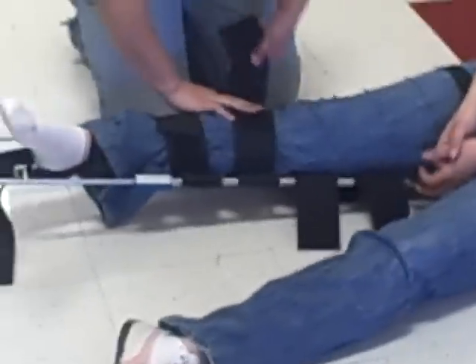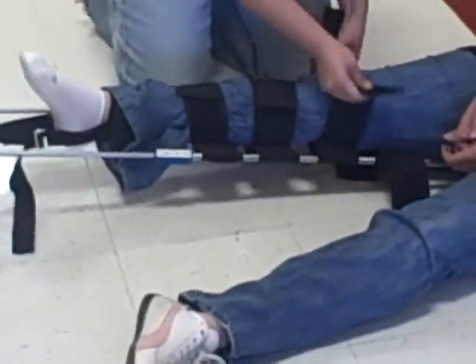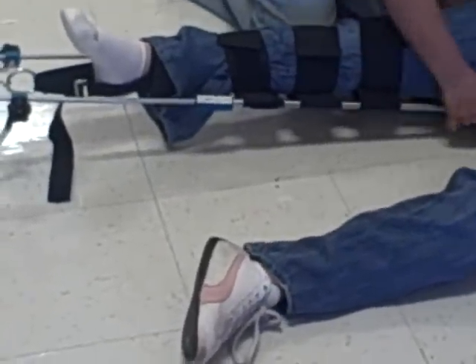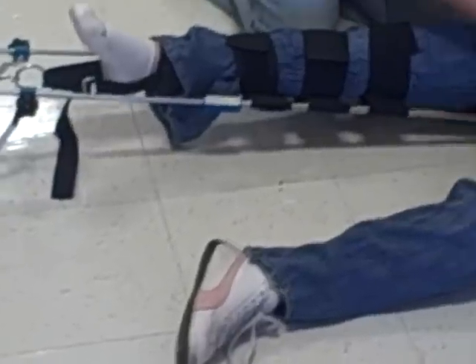I'll continue by immobilizing the leg. I'll immobilize below the injury and above the injury.